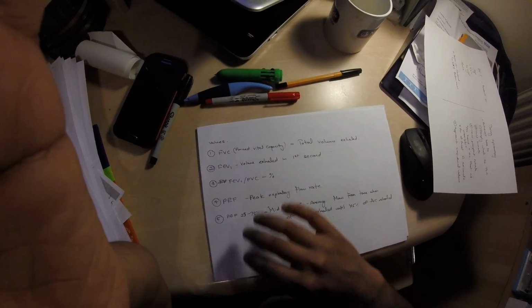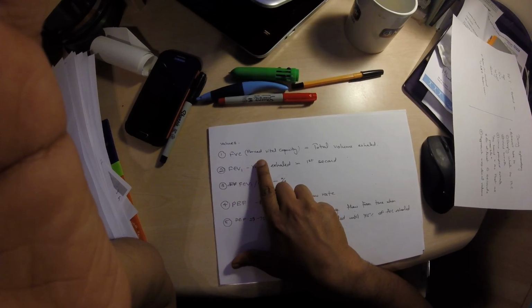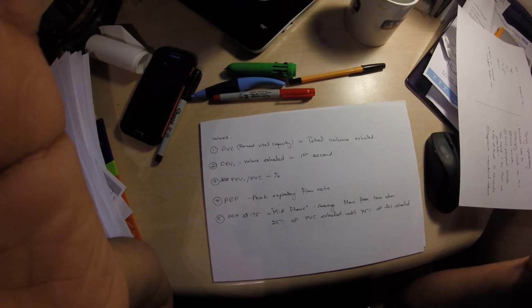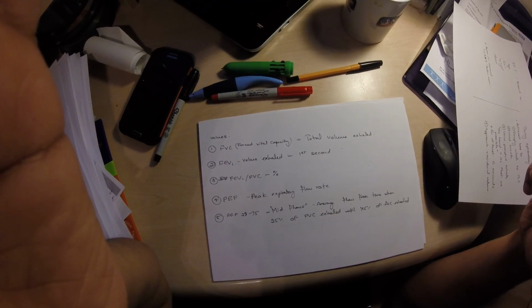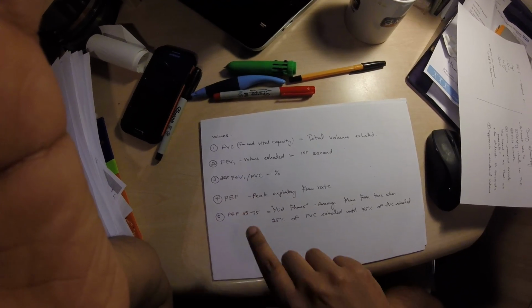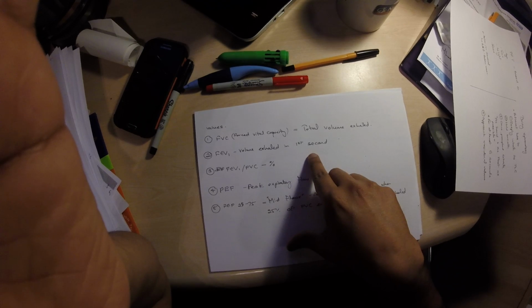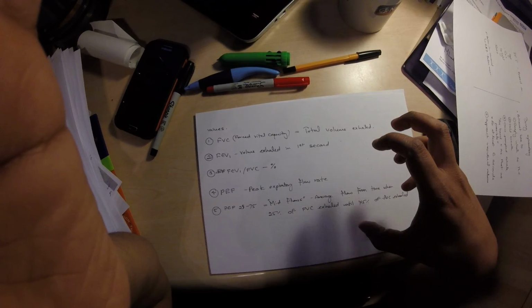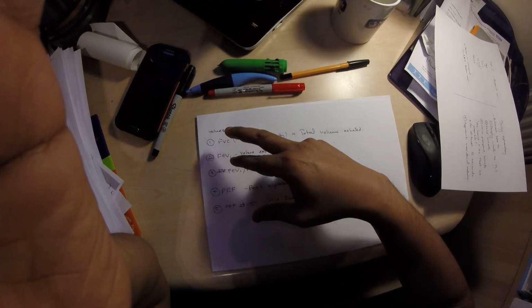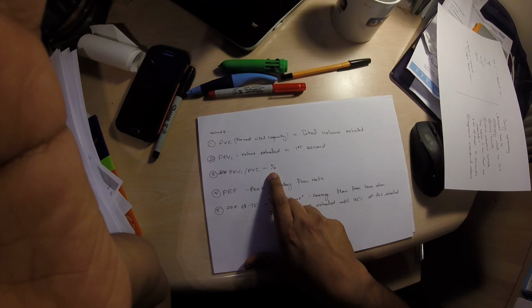The values we get from a spirometry are FVC, or forced vital capacity, that is the total volume of air that is exhaled; forced expiratory volume 1, or FEV1, which stands for the volume of air that has been exhaled as quickly as possible in 1 second. Then we put a ratio between these two, which comes out as a percentage or a ratio.